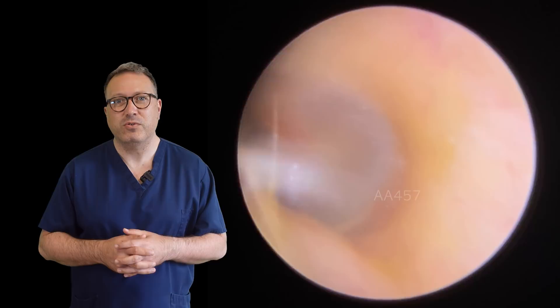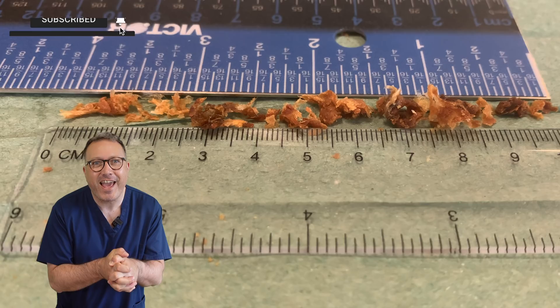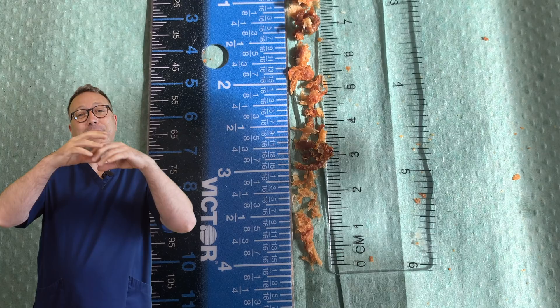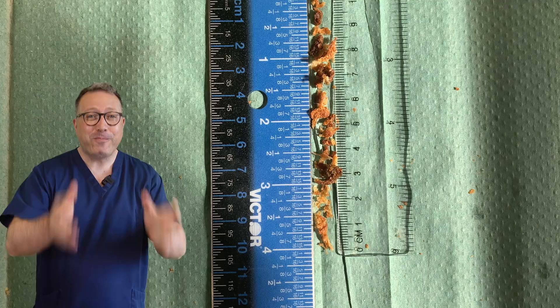Let's have another good look at that eardrum — eardrum looking nice and healthy, good light reflex there. And look at that — it's about 10 centimetres of wax from both ears. It's a pretty big one, and there were lots of these little pieces, but you can see there are some pretty chunky pieces in there. I've kind of grouped them together so I couldn't fit everything on the paper otherwise. But yeah, a fair old size piece of wax on that one. Well guys, I hope you enjoyed that video as much as I did voicing it — I've got a little bit hoarse, I've talked too much. But as always, take care of yourselves, take care of your ears, and take care of one another. I shall see you again real soon. Bye everyone.